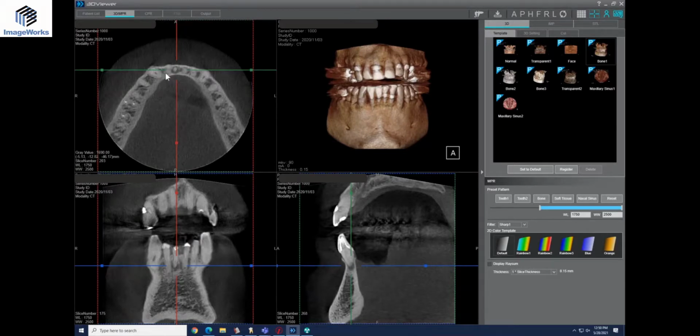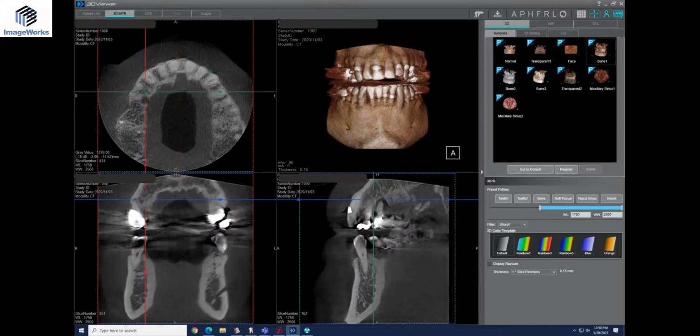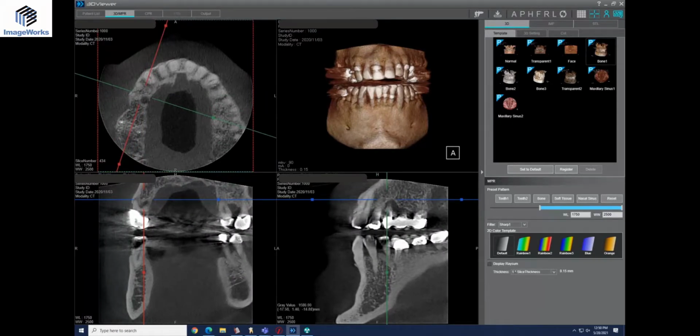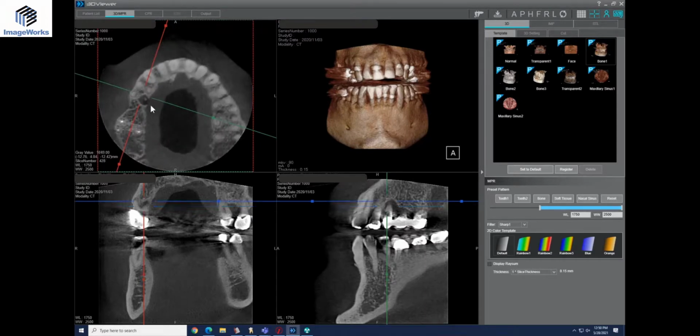Yep. But the neat thing about this cone beam was I started looking around. This is the one that on his upper arch, I'm finding this big infection here. And I go, what? Because he was totally asymptomatic over here. And it turns out that this is part of a bridge that was just really breaking down. You can see over here too. Oh, yeah. And it had blown out around the palatal root and blew out the palatal aspect. This palatal wall is all blown out.